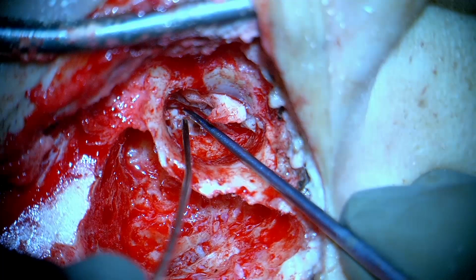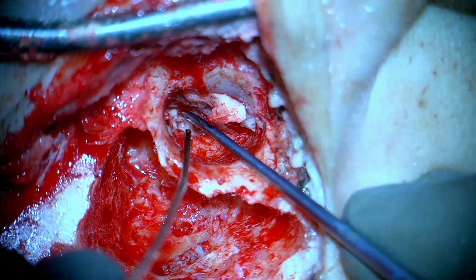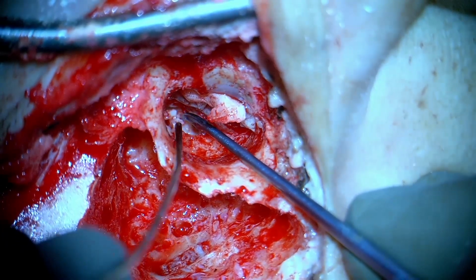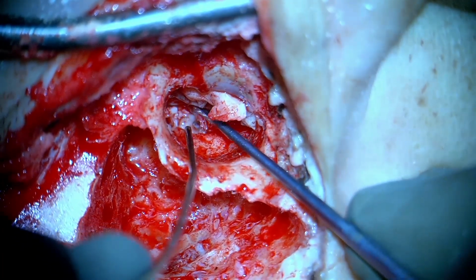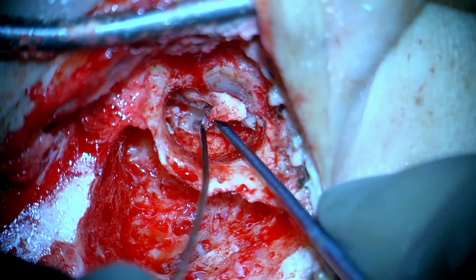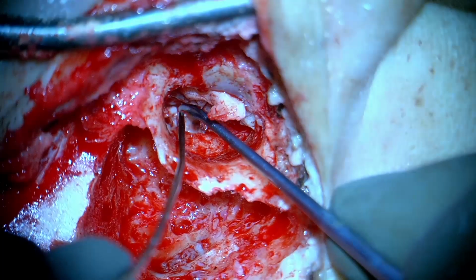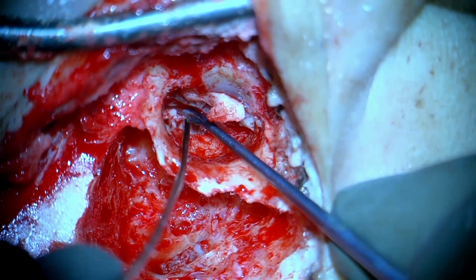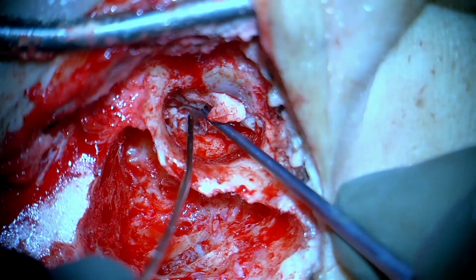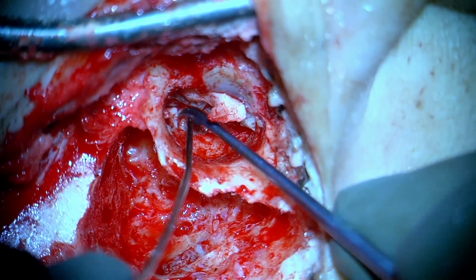And now you see how it's taking a lot of time and patience to completely clear the incudostapedial joint of any unhealthy, untoward mucosa or granulations, to be very sure that we're not leaving behind disease. So spending some time here could be totally worth it, and some small tags on the incudostapedial joint can then be cleared using either blunt or sharp instruments.